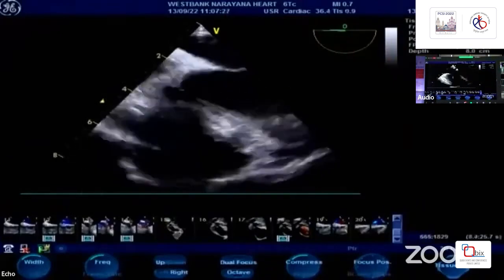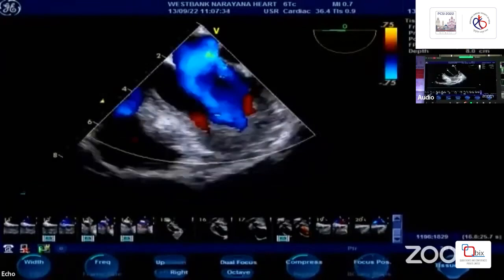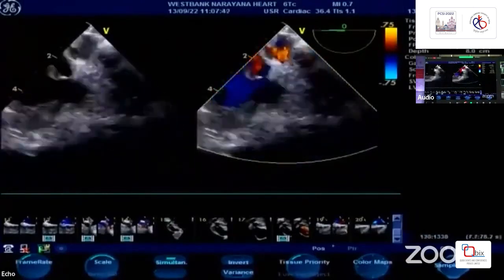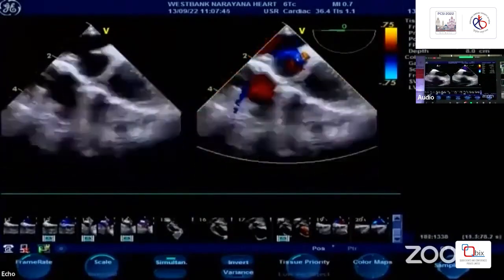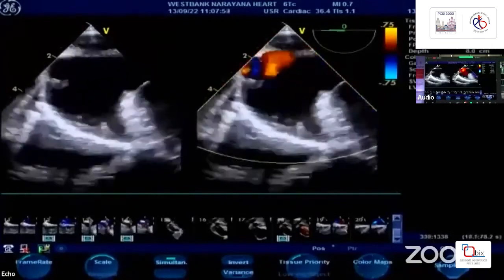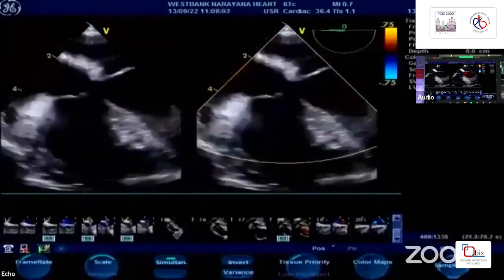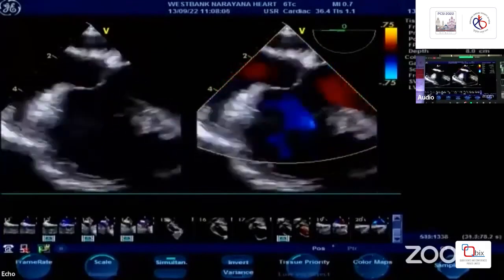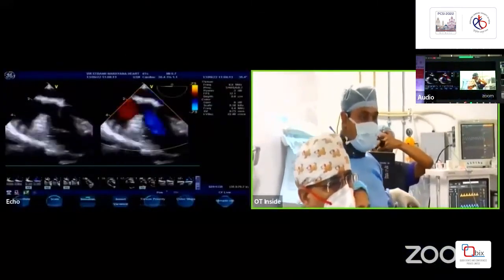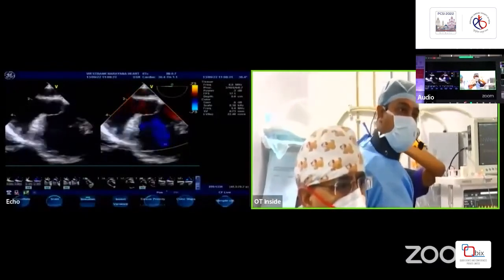One important finding: this child has a left SVC draining into the roofed coronary sinus with no left innominate vein, so there is a dilated coronary sinus. The left-sided pulmonary veins are draining into the LA, and the right-sided pulmonary veins are also draining into the LA. There is a dilated right atrium and right ventricle. The procedure will be performed by Dr. Amitav Chattopadhya and Dr. Joita. I will manage the transesophageal echo, with staff nurses Juhi and Manos, Shubhojit as technician, and Parijat handling anesthesia. Let's proceed.